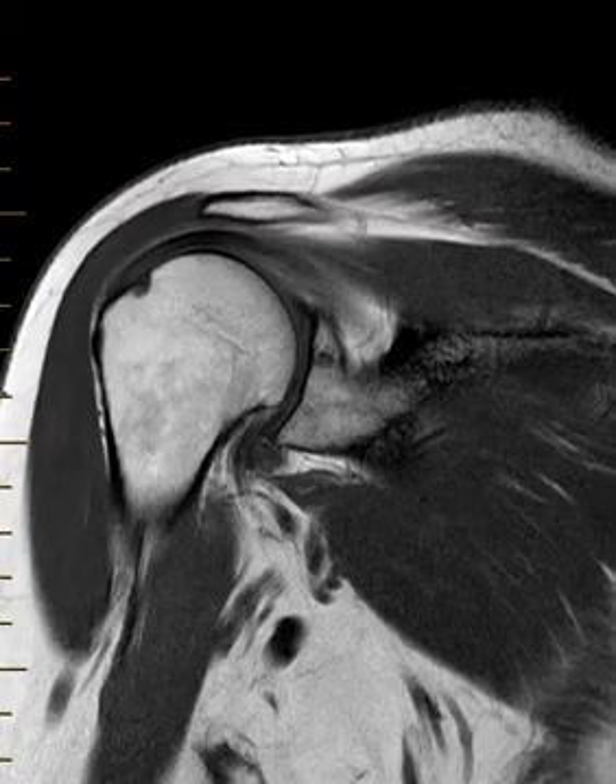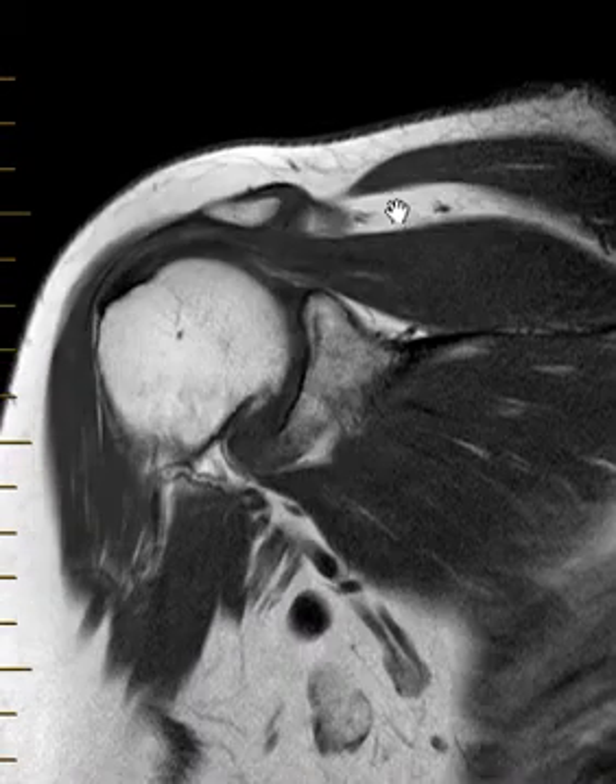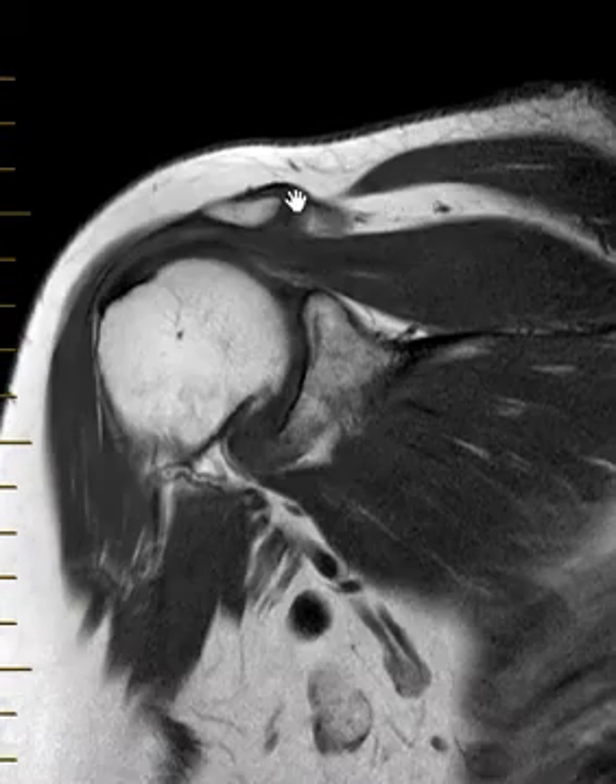Hello, this is Dr. Gay from FirstSec MRI. This is a 71-year-old female with a history of a prior injury. She's got shoulder pain and her MRI looks pretty good at first glance.